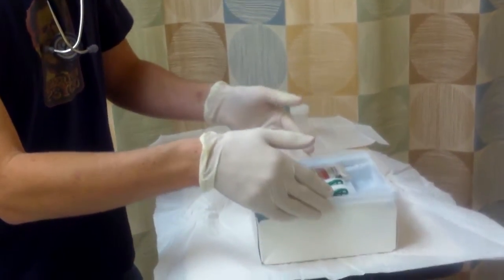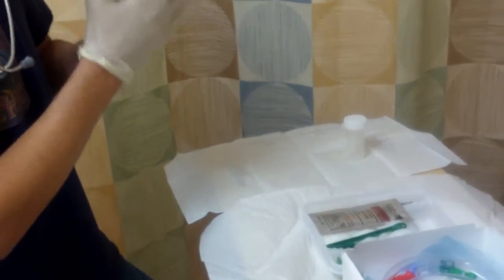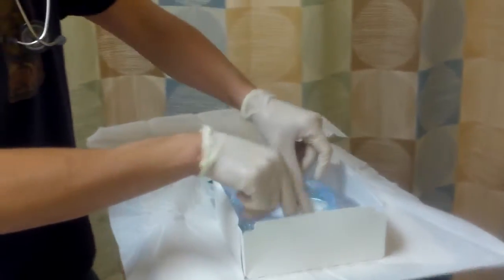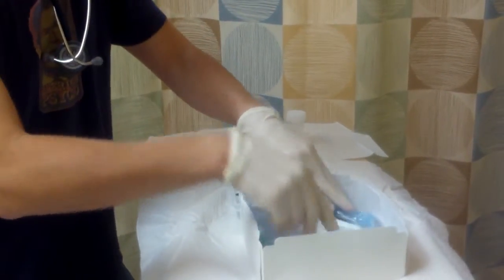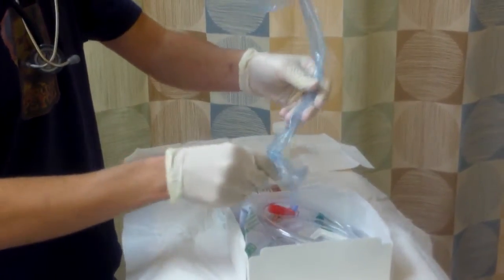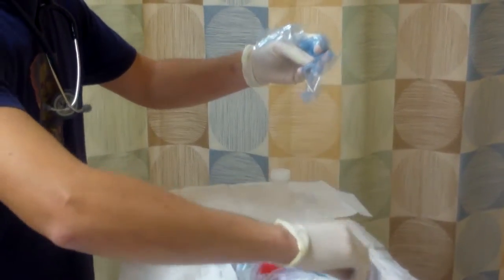Alright. I'm going to take out my tray. Do that, so then it's all contained. Can you see that? Yep. Okay. This is where I want to, let's just go in here and dig in the bottom and make sure that it's clamped. Okay, it's clamped, there we go. So I need to take this out. So then I'm just going to slowly do that. Okay, there we go.